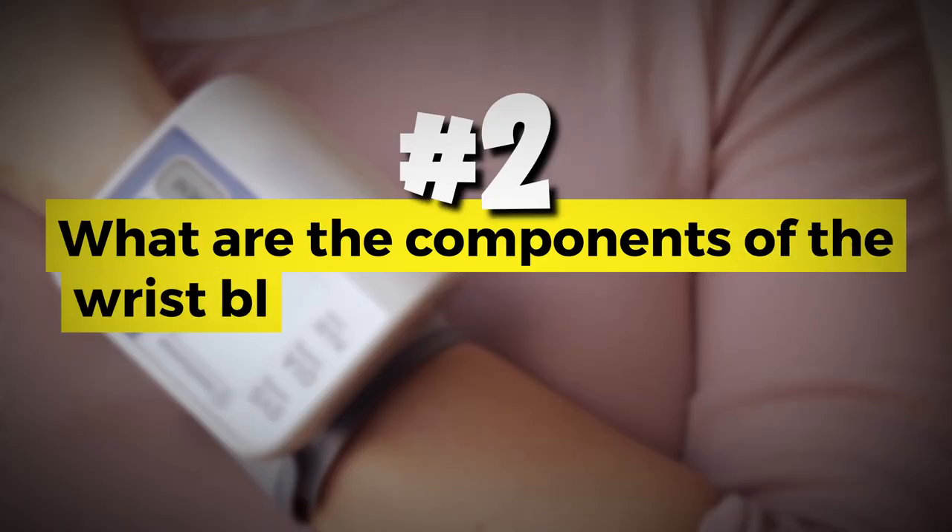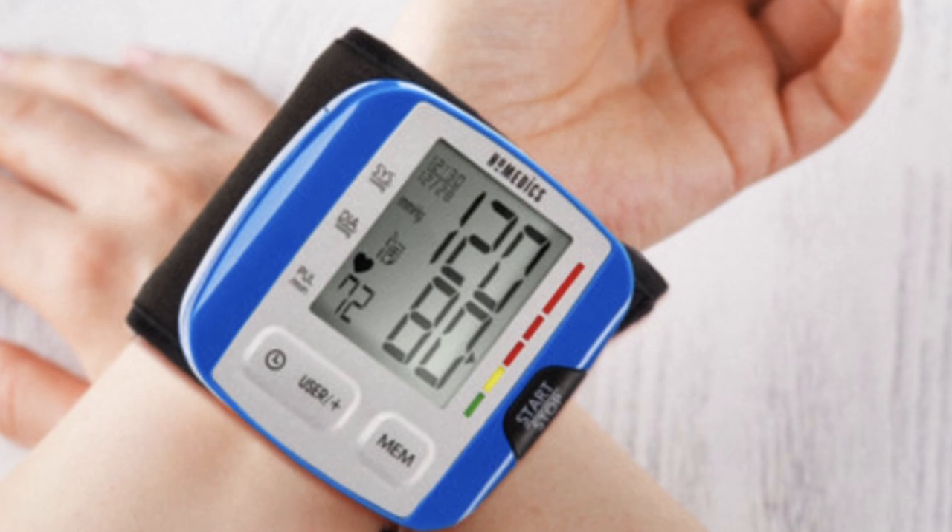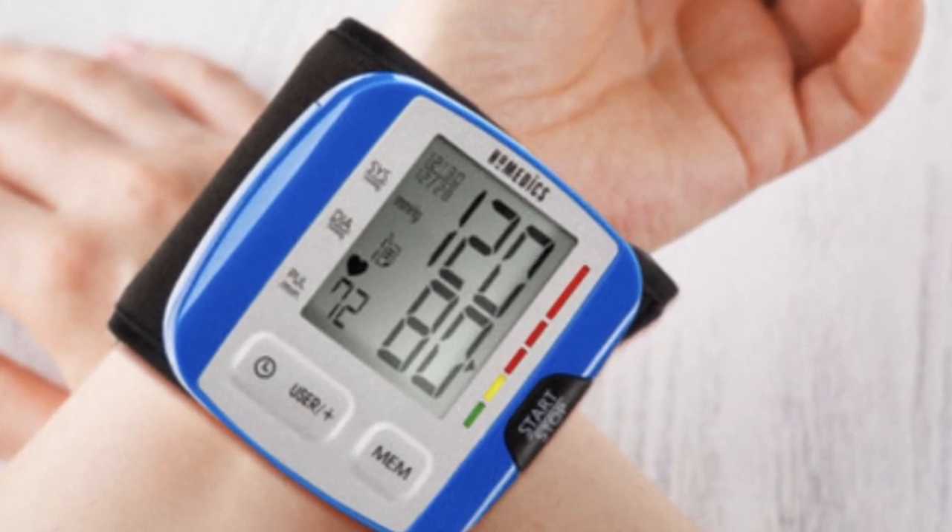What are the components of wrist blood pressure monitors? They all have a cuff that wraps around the wrist, a display unit, and buttons for control. Some advanced models may also include features like irregular heartbeat detection, memory storage, and download capabilities.